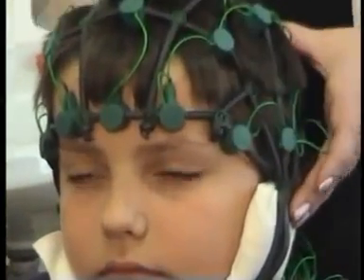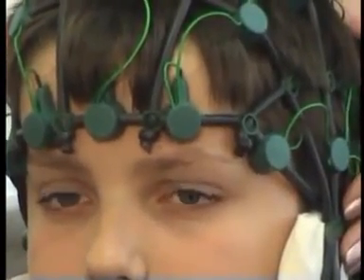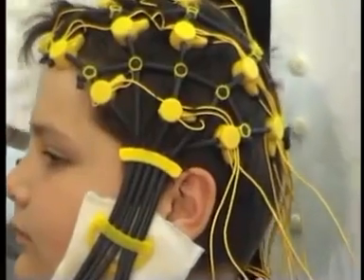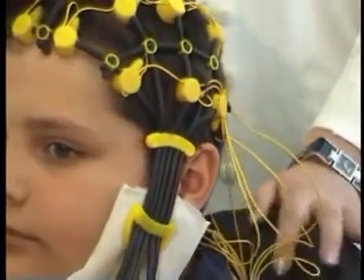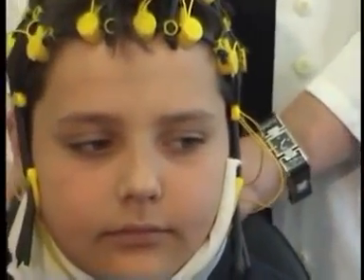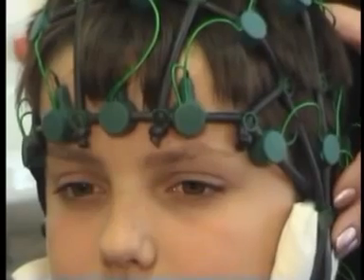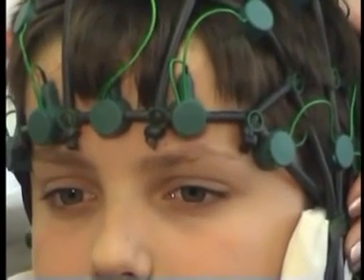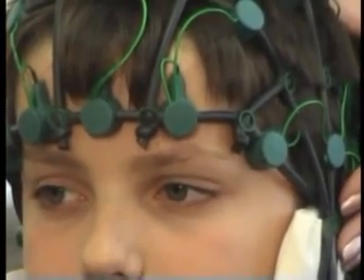In both cases, the areas where cortical activity is measured are not those chosen by specified electrodes. This can cause an error in the test result interpretation. Naturally, regardless of correct choice of size and electrode placement, EEG potential will be detected. However, the relevant question is, potential of which part of brain?